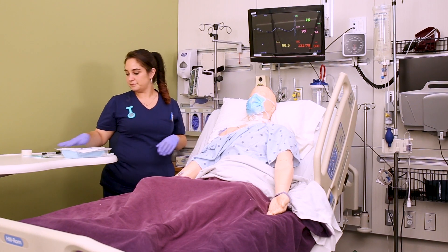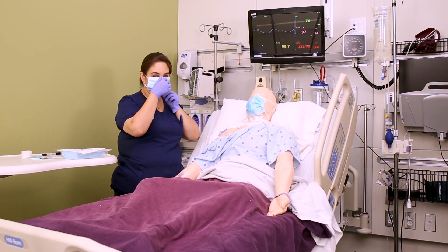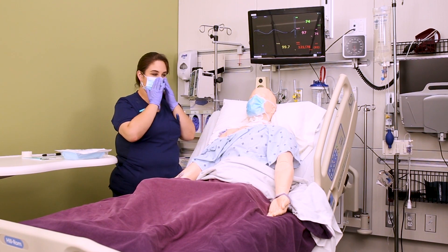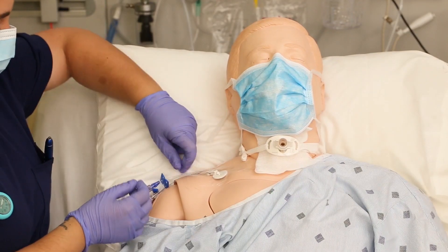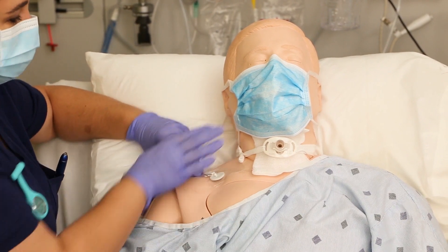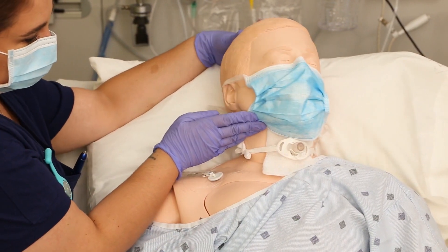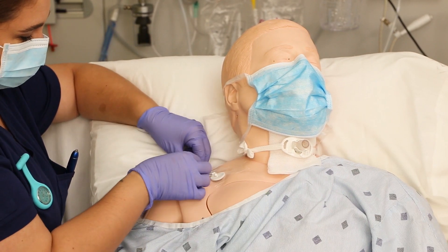Once you've gathered all your supplies on the bedside table, apply a mask to yourself and the patient. Sometimes the kit comes with a mask inside, but always grab extra masks and do this step first for safety and infection control. Make sure the patient turns their head away from the site as you're removing the old dressing to keep them from breathing or coughing on it.